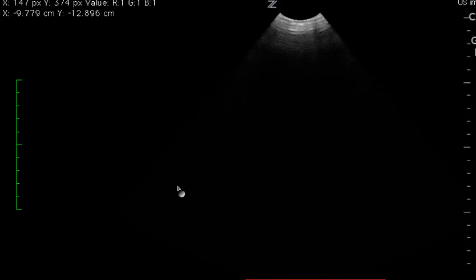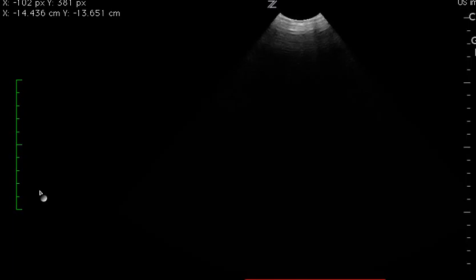I'm not sure if the probe is losing contact with the patient, but the way it works on both machines is you press the save button and then it starts the save. That's called prospective saving — once you press the save button, you have six seconds to obtain as many images as possible.